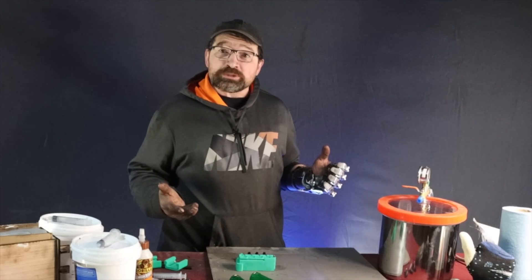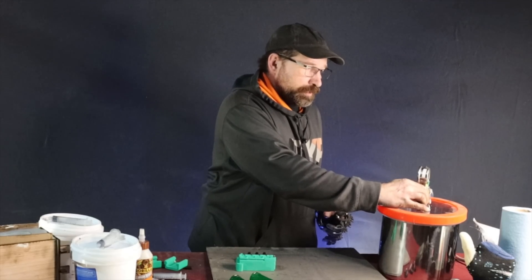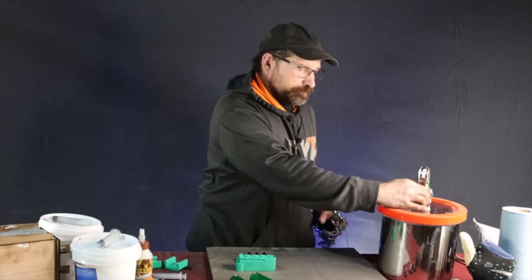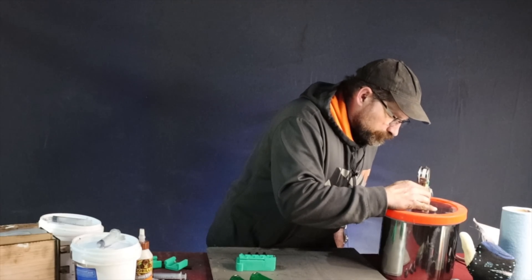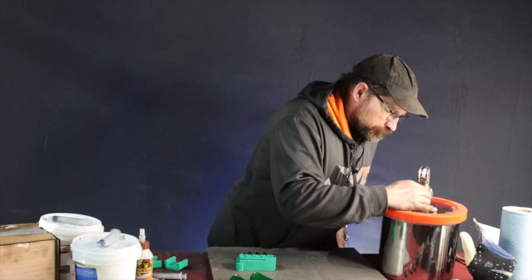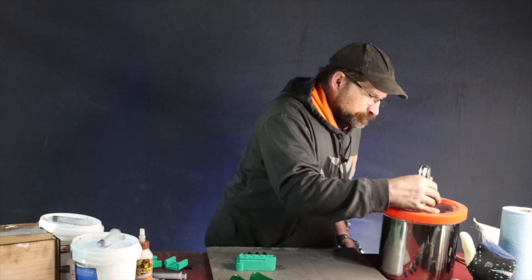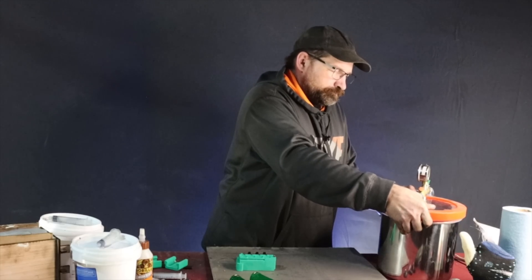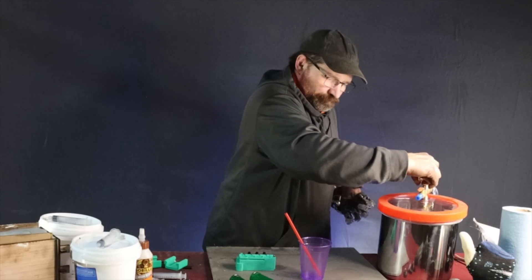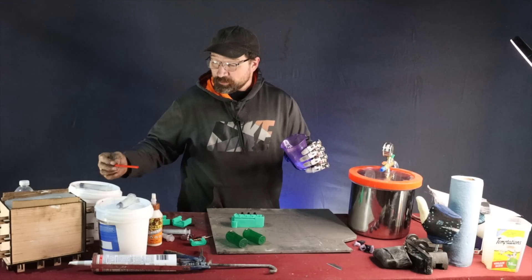Now that the bubbles have slowed down, go ahead and turn off your vacuum pump, then slowly open up the valve. Now go ahead and fill the molds.